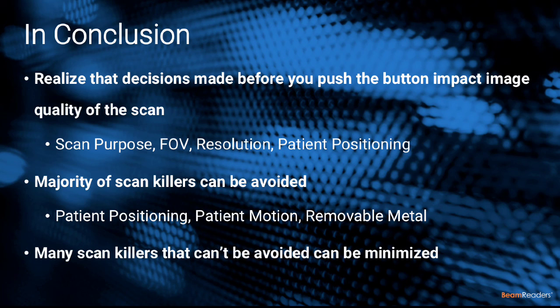So in conclusion, many of these scan killers can be minimized if we can't avoid them completely. And our goal, again, is to create the best image with the lowest amount of exposure.